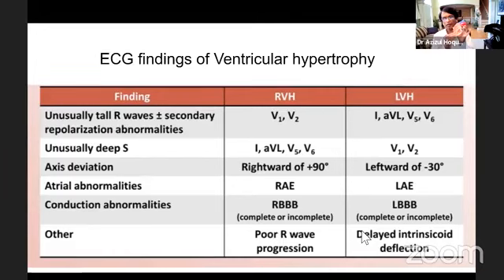If you have left ventricular enlargement, then the axis is going to go to the left side, right? The left side is represented by lead 1, AVL, even minus 30 degrees to the left shoulder area, and V5, V6. Look at those leads, and you'll see all the criteria depend on them. Like the Cornell criteria, they have AVL. Modified Cornell, also AVL, because those are on the left side.